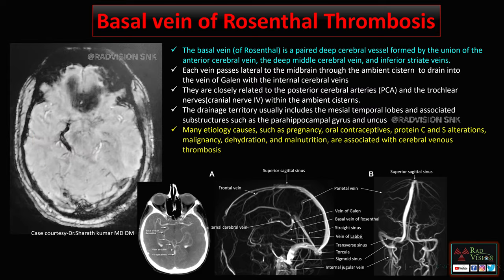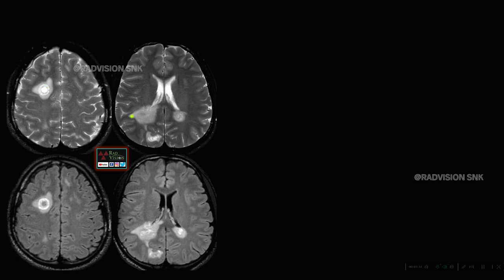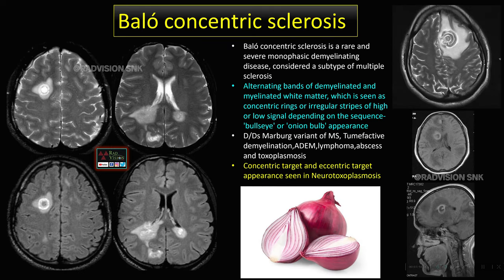Next case: here you can see there are alternating areas of hyperintense and hypointense signal which typically mimic a bullseye or onion bulb type of appearance, with perilesional edema in the frontal lobes and also in the parietooccipital lobes, showing peripheral ring-like enhancement.